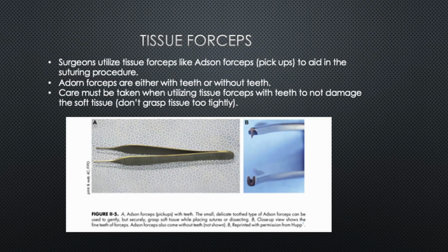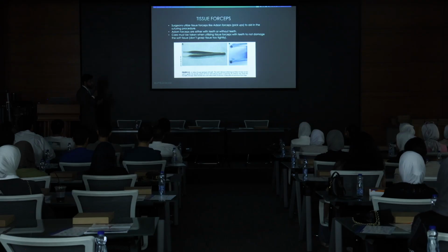They could aid in moving the tissue and approximating the tissue. They could come with teeth or without teeth. Care must be taken whenever you use the ones with teeth because you might cause some trauma to the tissue. Don't grasp it too tightly.